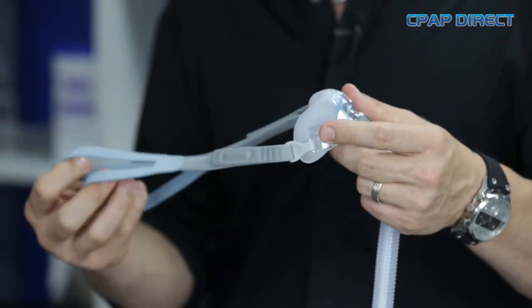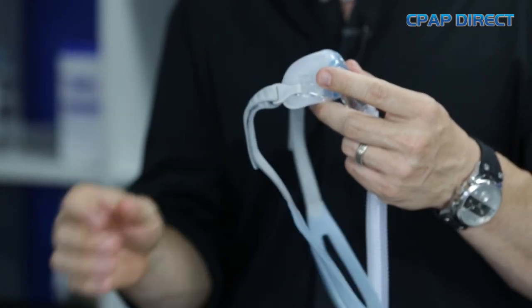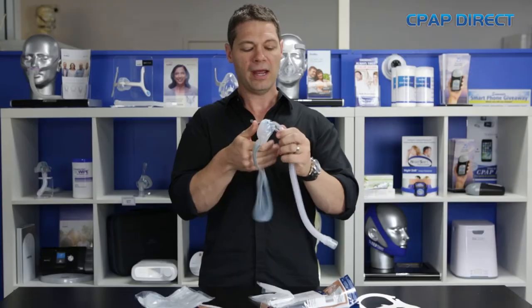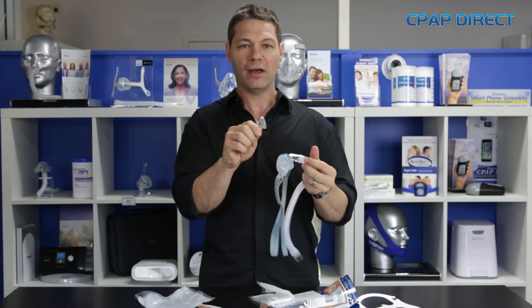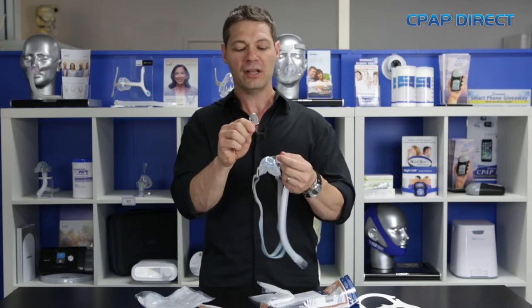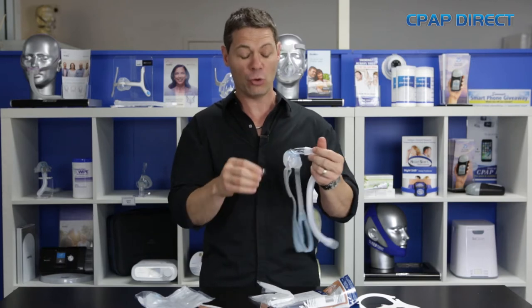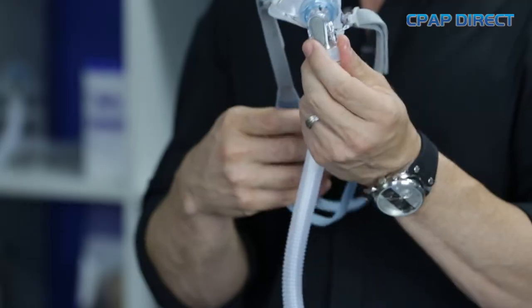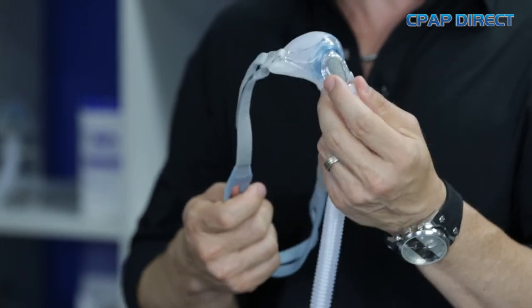I'm a fan of a nasal mask personally, but I really think this is probably the most unintrusive pillow mask because the pillows are still inflatable. It has a washable diffuser on the front — I'll just pull that off. Rather than the disposable filters that come with other types of masks, this one like the Ison 2 is now washable, so you don't need to throw it away, and you also get a spare one in the pack. The diffuser stops exit air blowing over the person lying next to you and also makes the mask very, very quiet.